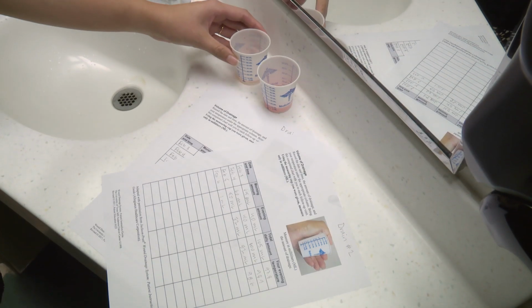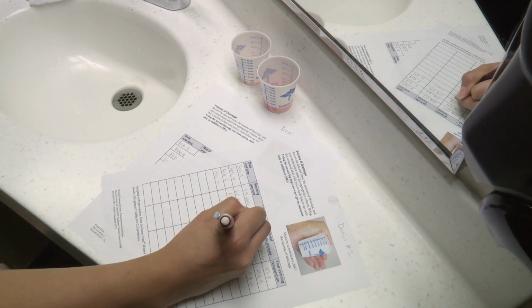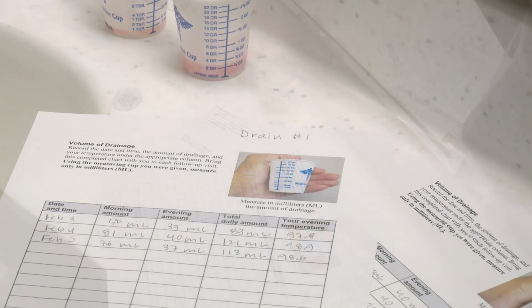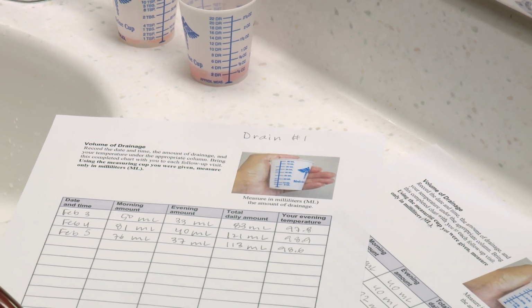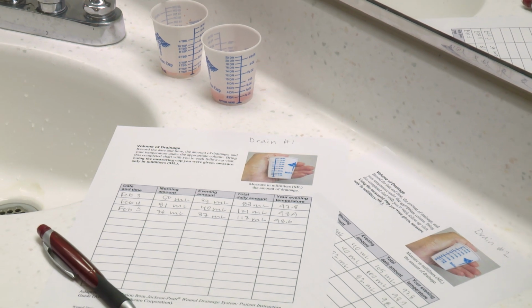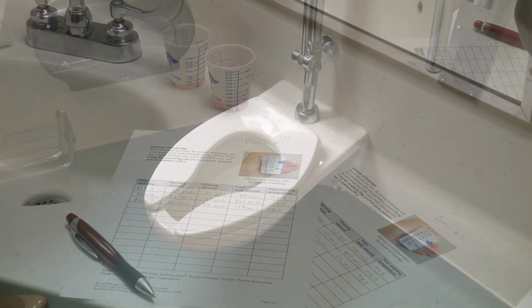On the volume of drainage chart, record the date, time, and amount of fluid collected from each bulb. Your nurse reviews your volume of drainage chart. This information is used to determine if your drains can safely be removed.